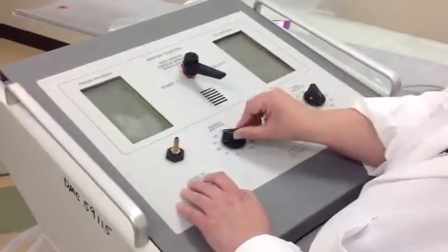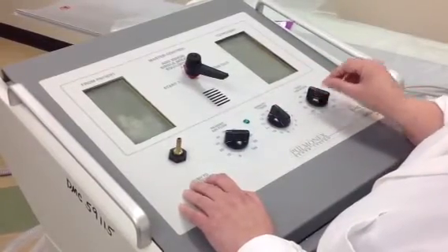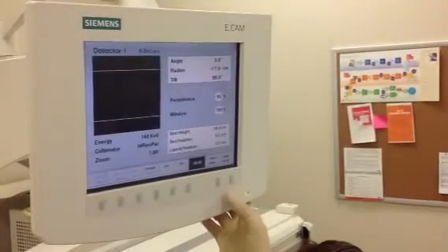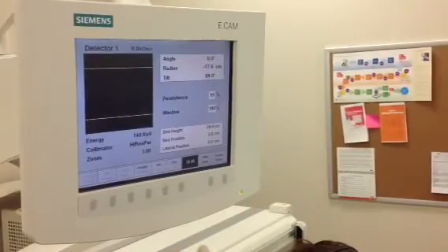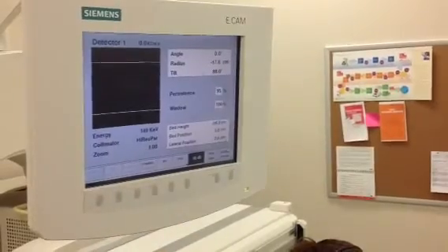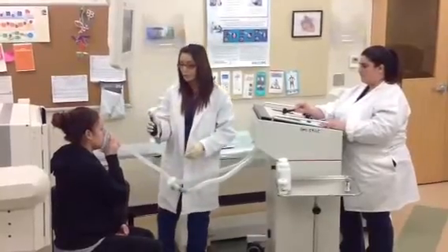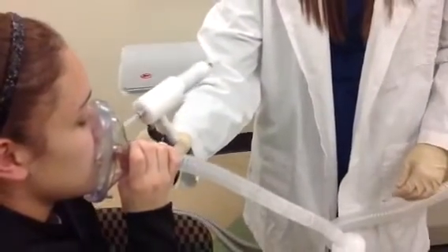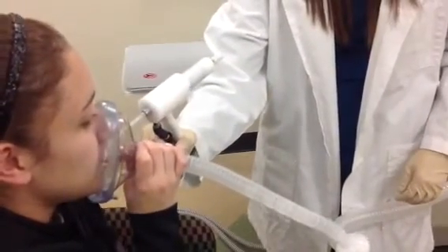Return the control to approximately 1/2 of its range when the study is complete. The use of this trap motor control will be a rare occurrence. Do not adjust unless absolutely necessary and be sure to return it to its original position. To be effective, the increase in motor speed must be accomplished before the bag is full. Thus, it is vital to watch the front patient bag carefully during washout.